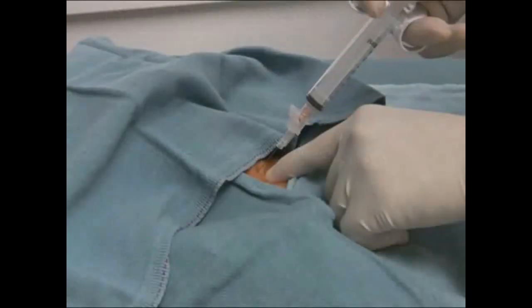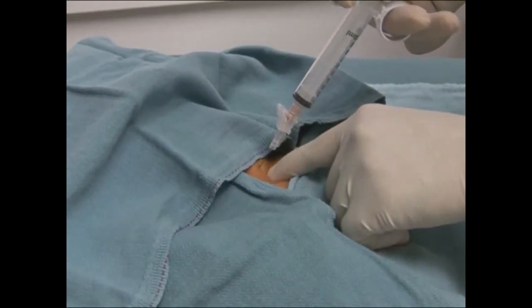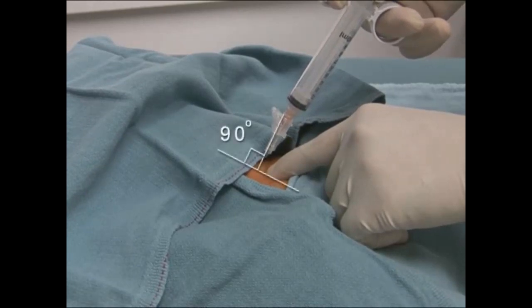A 10cc syringe with a 23-25 gauge needle is carefully advanced through the skin just superior to the pubic symphysis. Be sure that the angle of the needle is at 90 degrees with respect to the abdominal wall, or slightly caudad, to direct it towards the bladder.